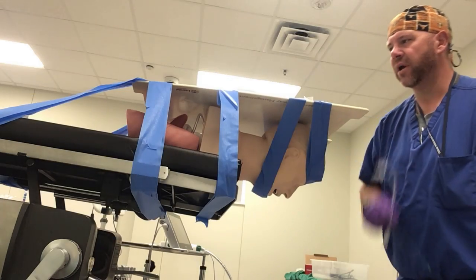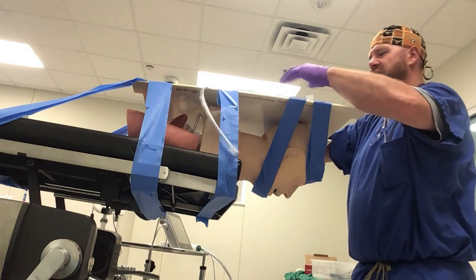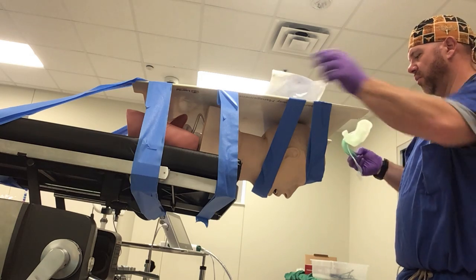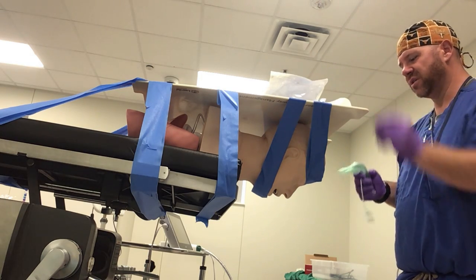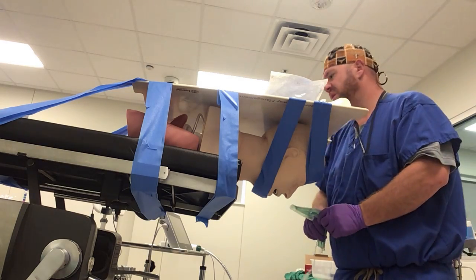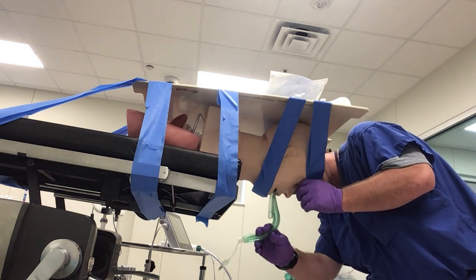When using a fiberoptic scope to replace a lost airway, the nice advantage of doing this is that you're able to place the LMA quickly and start ventilating your patient. We're using the Ambu brand scope as well as their airway, but any intubating LMA should be adequate. So you can easily place your LMA and begin ventilating your patient.